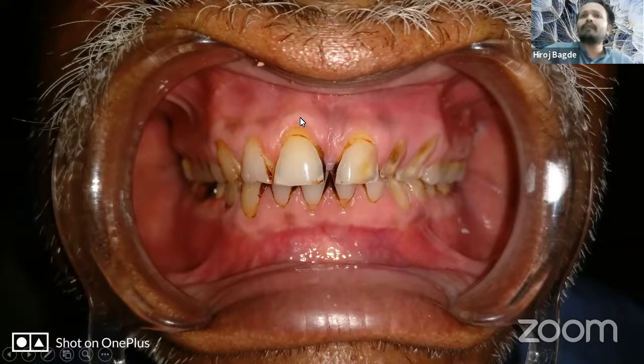But if a DSLR had been used here, definitely I would have captured everything in focus, because I can manipulate and change my F number when using a DSLR. So my focus was this.